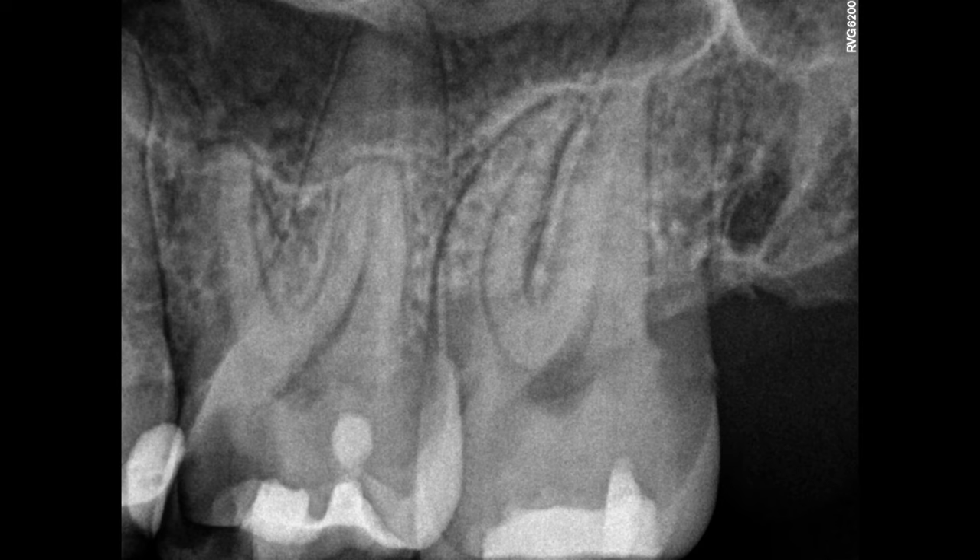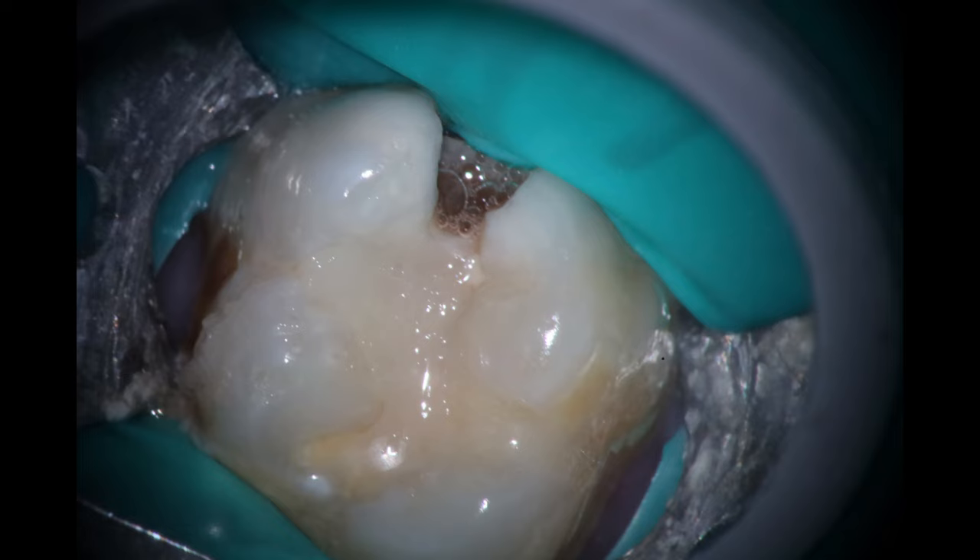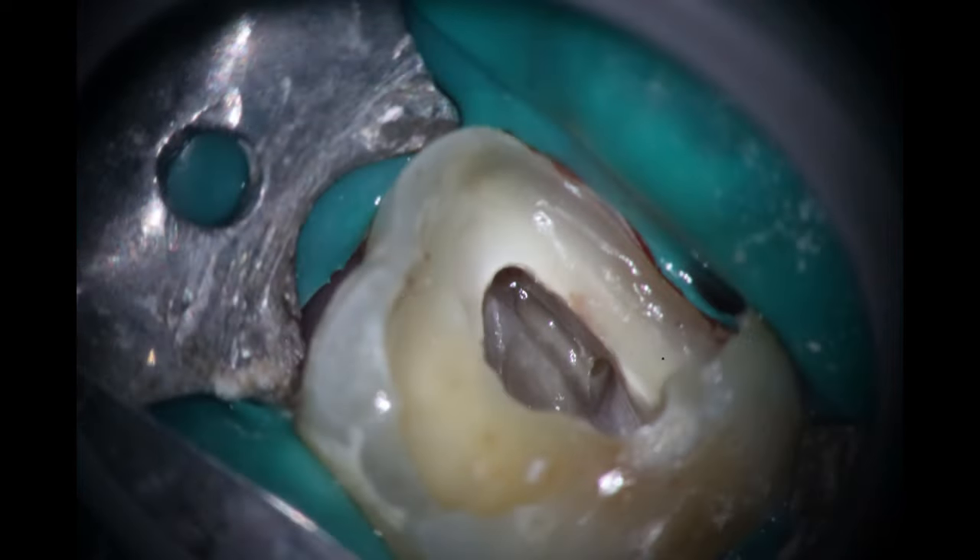What I did is I kind of did a completely unedited version of this, so you'll literally see full time — there's no cuts. This is the case; we've already at this point cleaned out the caries, obturated the canals, and we are ready to fill it up. We just took our check film and here's where we go in.